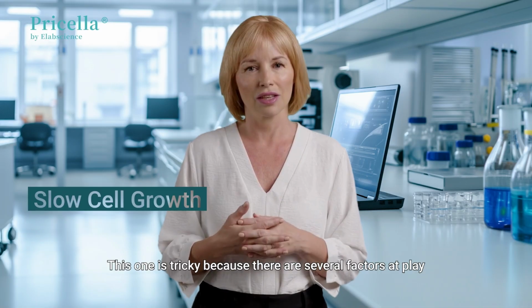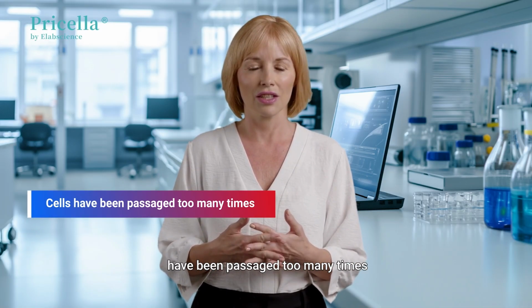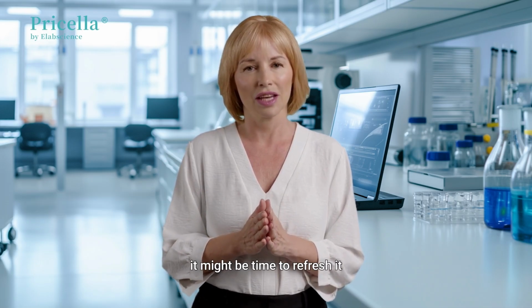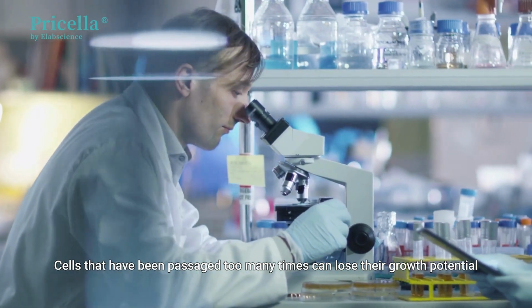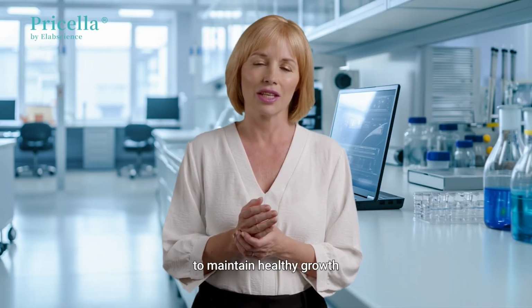Now, let's address slow cell growth. This one is tricky because there are several factors at play. One of the first things to check is whether your cells have been passaged too many times. If you've been using the same stock for a while, it might be time to refresh it. Cells that have been passaged too many times can lose their growth potential. Ideally, you use a new stock that's been subcultured fewer times to maintain healthy growth.